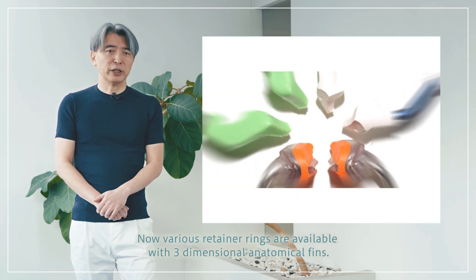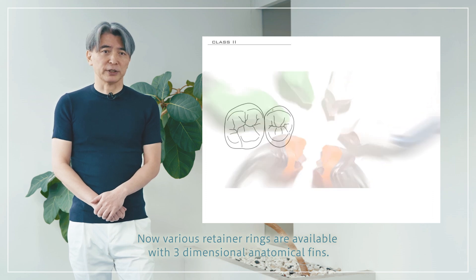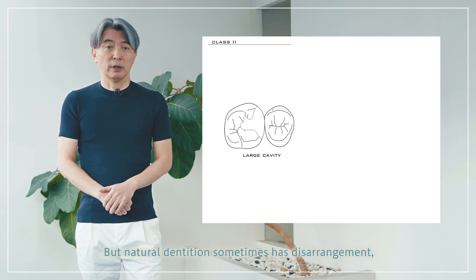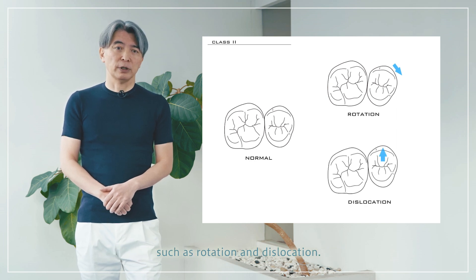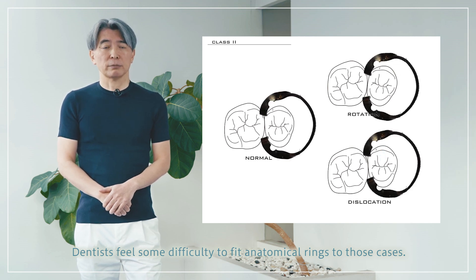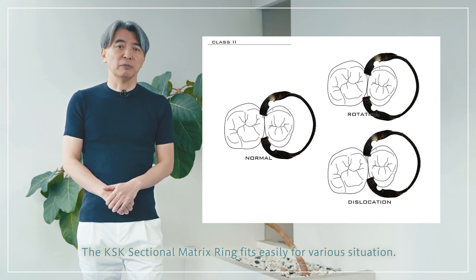Various retainer rings are available with 3-dimensional anatomical fins. They work effectively, especially for large cavities. But natural dentition sometimes has disarrangement, such as rotation and dislocation. Dentists sometimes find it difficult to fit anatomical rings in those cases. The KSK sectional matrix ring fits easily for various situations.